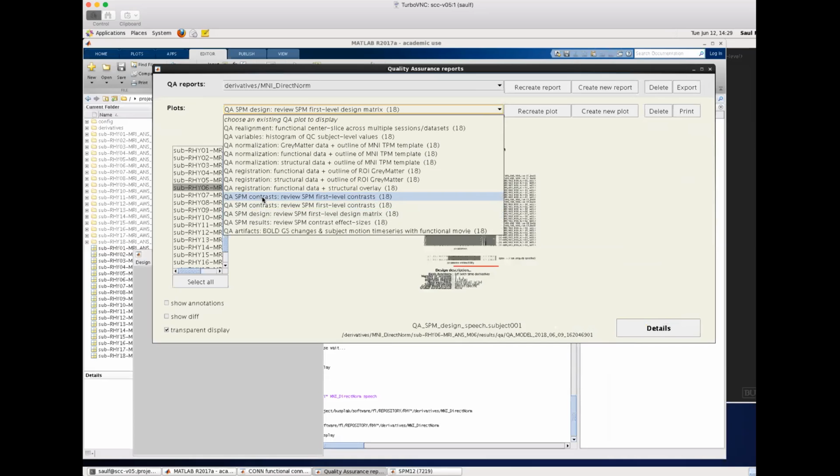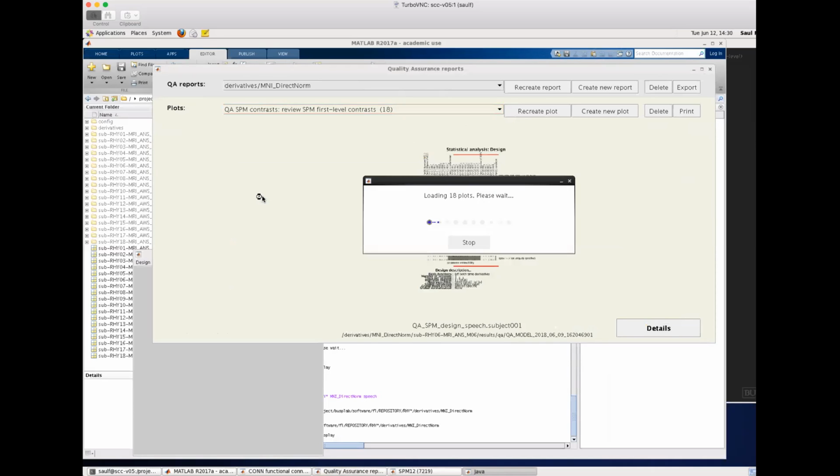I was generating two because there is an option to remove any contrast that is not using all truly estimable effects. If you use that option, you will have two different contrasts: the ones you had before that removal and the ones you had after it. That is unlikely to be used in general, so I'll just remove the generation of the two contrast plots and keep one. In your case, the two plots are going to be exactly the same.